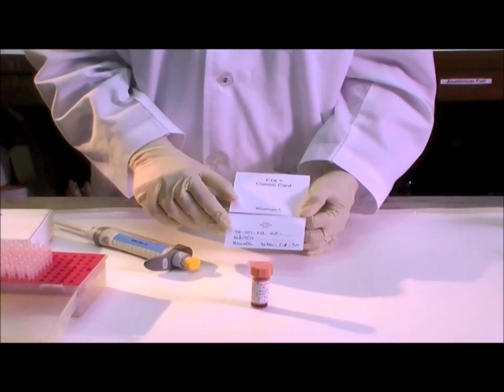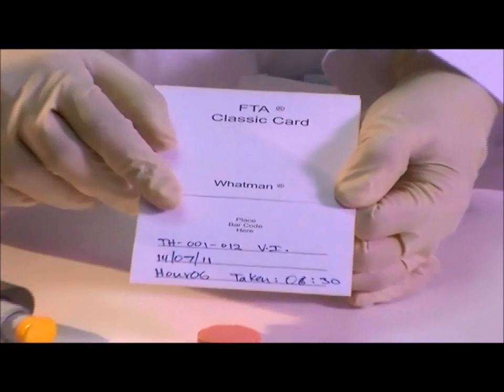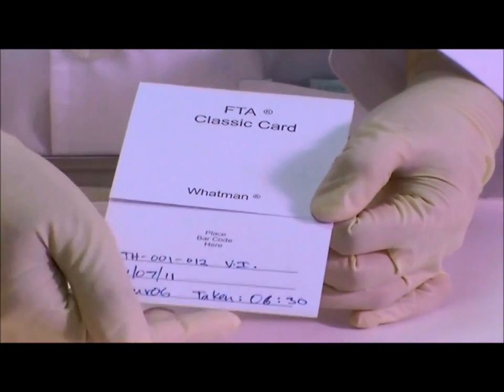Label the FTA card with study subject number, initials, date, time point, and time of actual collection.